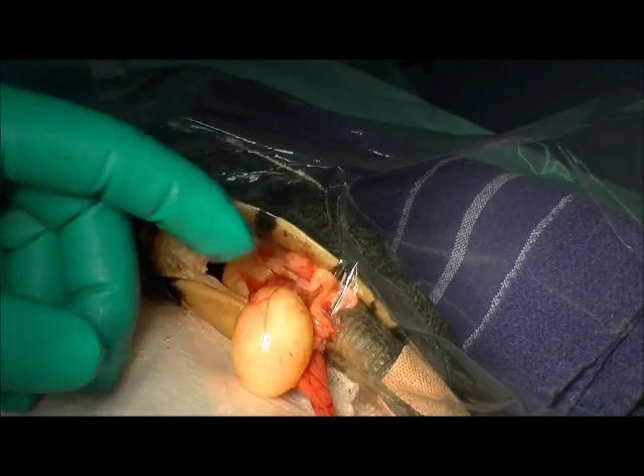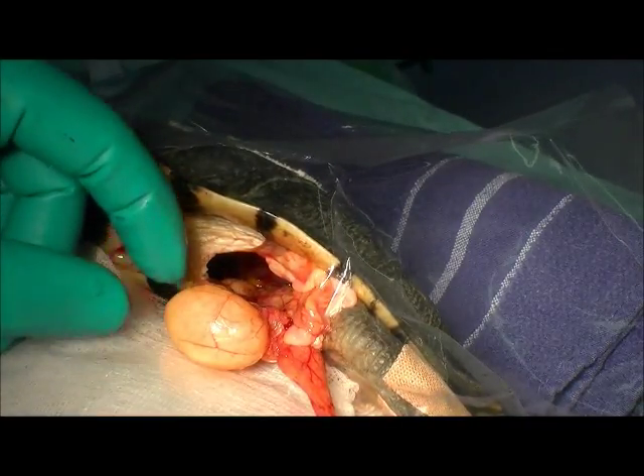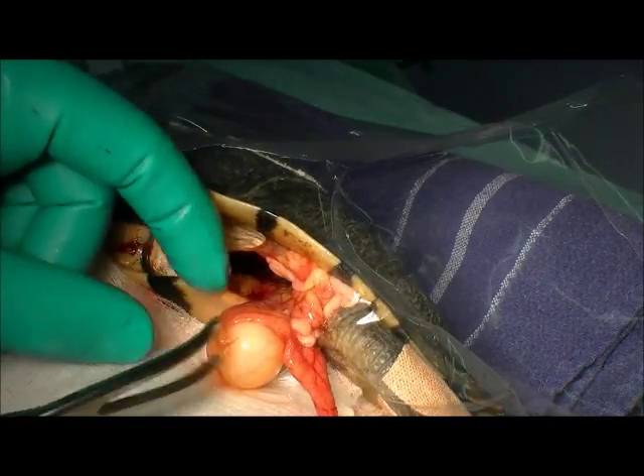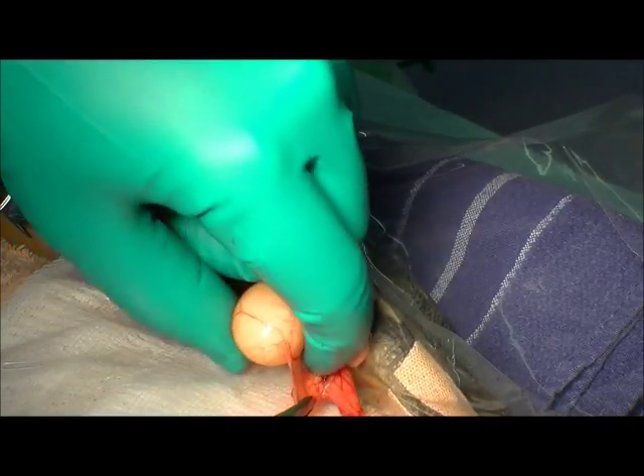Remember the reason we're doing this is because she has a fractured pelvis and I'm worried she's not going to be able to lay the eggs naturally — in the wild she would most certainly be in serious trouble. We're going to keep going until we get as many out as we can on this one side, and if need be we can roll her over and do the same procedure from the other side of the body. There's also a technique where you can cut through the middle of the plastron underneath, but cutting through shell is much more labour intensive and takes a lot longer to heal and to get back in the water. This pre-femoral approach is the preferred technique.